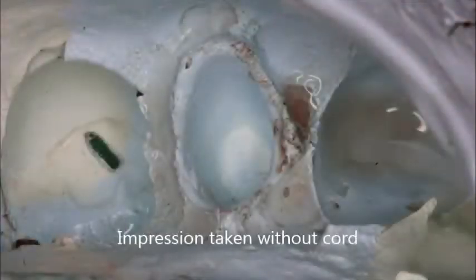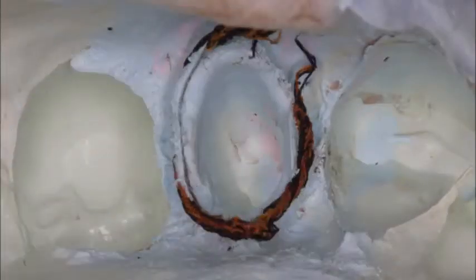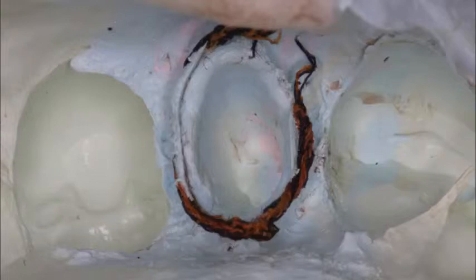The first attempt with this impression was taken without any retraction cord. However, the margins could not be circumferentially visualized. The second attempt with this impression was taken with a single cord left in the sulcus. In this impression, the margins were completely captured.